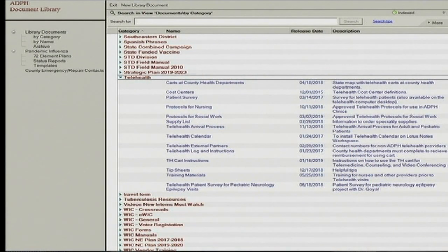We are now going to have a patient and provider interaction and have the distant provider call the telehealth cart. Before the distant provider calls the cart, it is important to remember to have the stethoscope and its application up and running, as well as the handheld camera and its application up and running. Before every appointment, there is an arrival process that dictates what the provider's staff would like for you to do before calling the provider. This arrival process is in the document library.